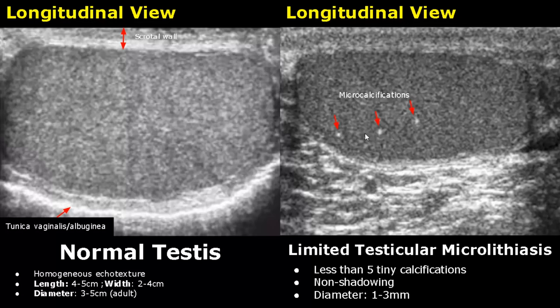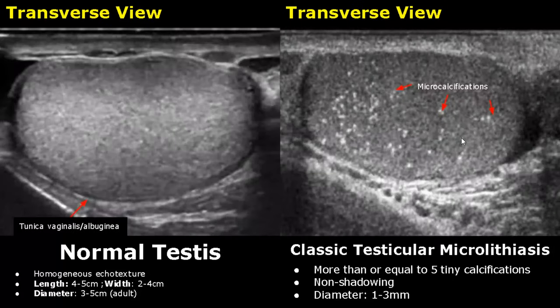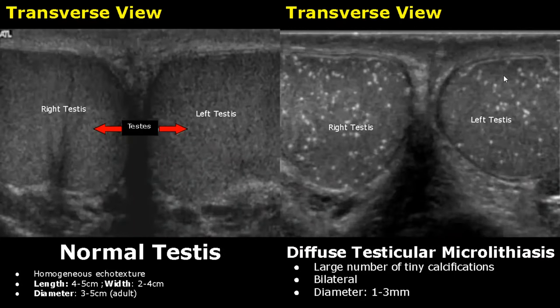Limited testicular microlithiasis consists of tiny calcifications inside the testis that are less than five in number. They don't have any shadowing and measure 1 to 3 millimeters in diameter. Classic testicular microlithiasis will have five or more tiny calcifications. In diffuse testicular microlithiasis you can see a large number of tiny calcifications in both the right and left testis.